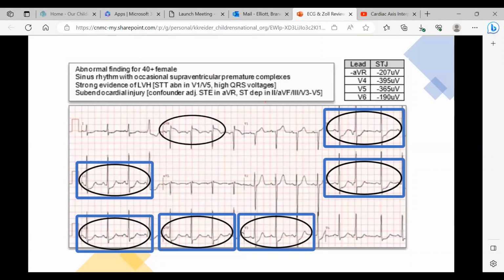So AVR elevation is shenanigans and can mean so many things. But the problem with it is maybe only like 10% of those are actually STEMIs. The problem is, if they are STEMIs, they're really, really bad STEMIs. And I don't think they'll have this high of a heart rate while perfusing adequately. So patients will tell you they're having a STEMI because of the signs and symptoms.